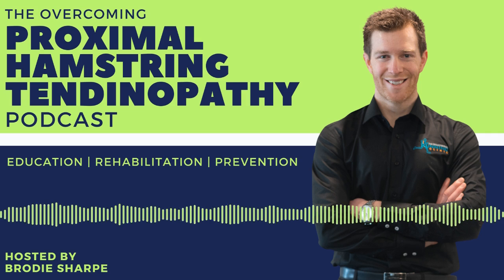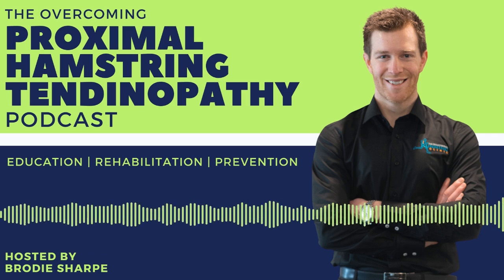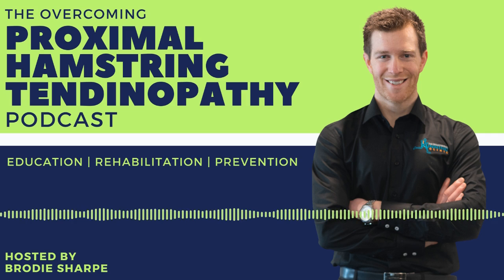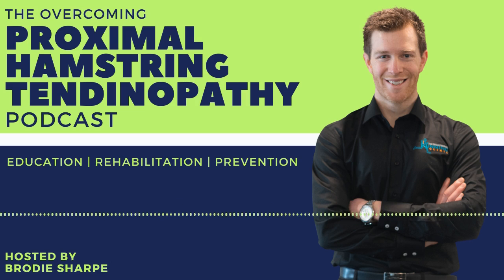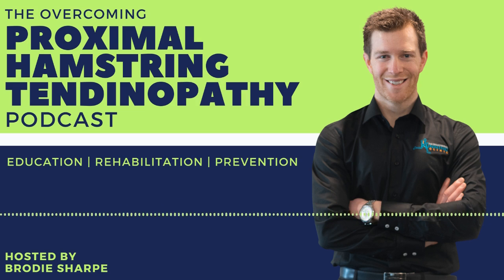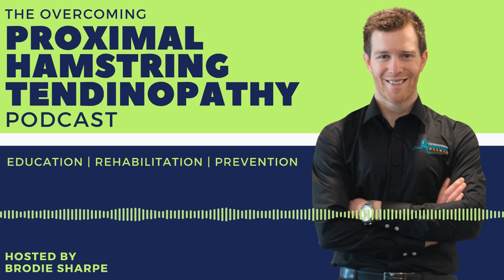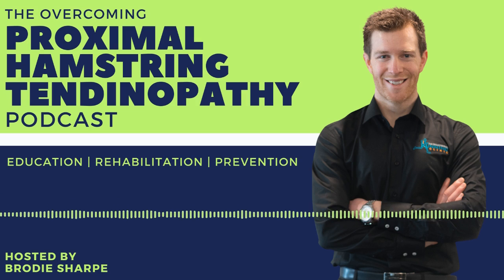And when you're giving the Shockwave, if you look at the anatomy, the sciatic nerve is around 3 to 4 centimeters lateral to the tuberosity. So when you're giving Shockwave, always aim medially. Don't go laterally. And obviously, if a patient says something when you're giving treatment, listen. I've seen two patients actually who had raging sciatica after they completed a course of Shockwave, where the patient complained of having pins and needles while they were having treatment.